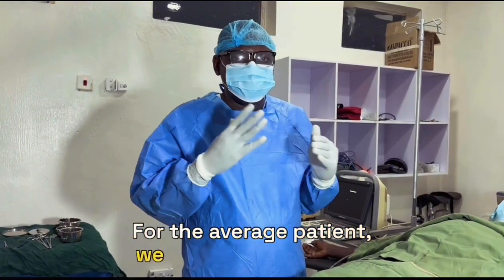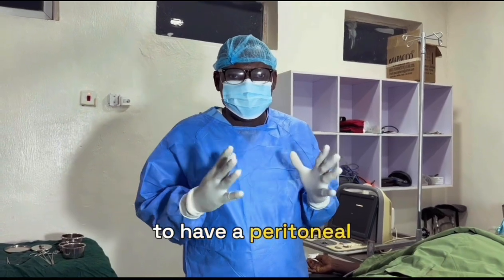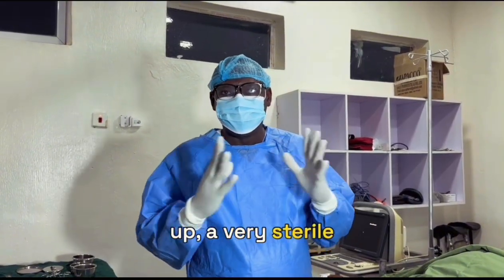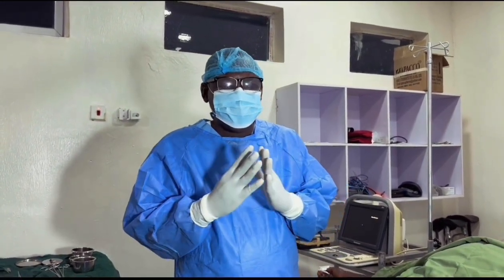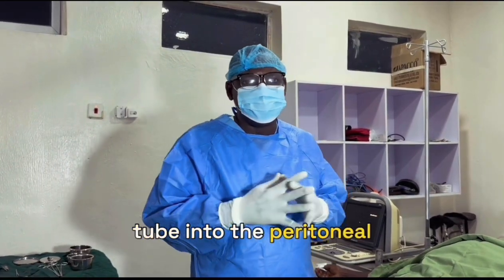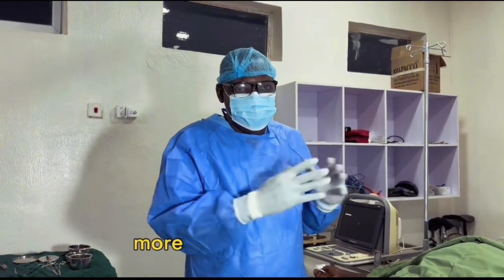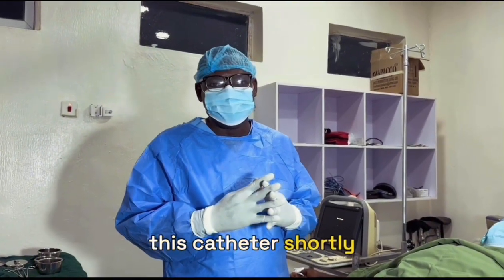The average patient will spend about 400 to 600,000 to have a peritoneal catheter inserted into the peritoneum, usually because it requires a theater setup, a very sterile procedure, and a bit of a mini surgical procedure where we'll put this flexible tube into the peritoneal cavity. So the insertion fees will be a little bit more than hemodialysis. I will just demonstrate how to put this catheter shortly.